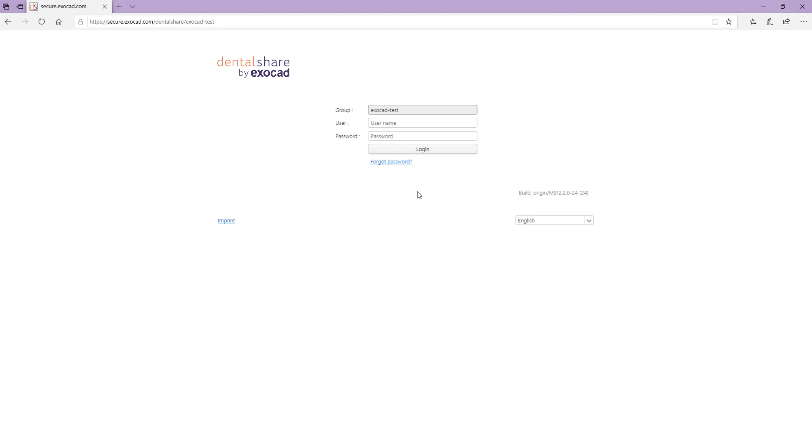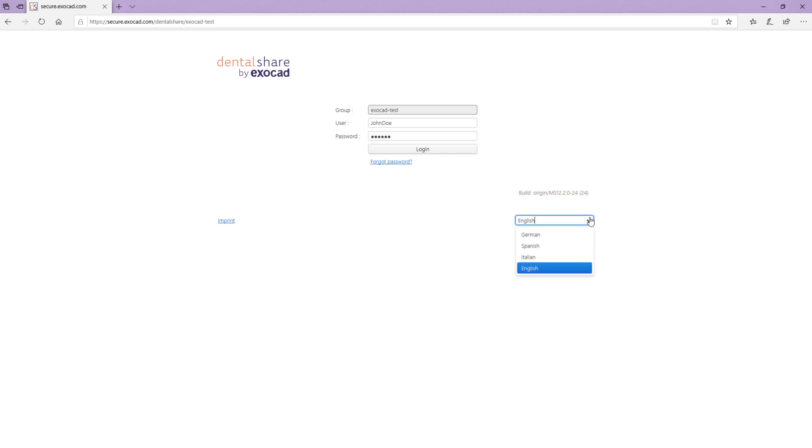Your group will be already entered. Enter your username and password and select the page language using the drop down menu in the bottom right hand corner.